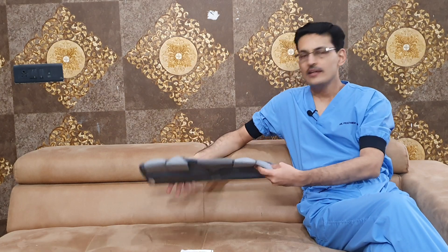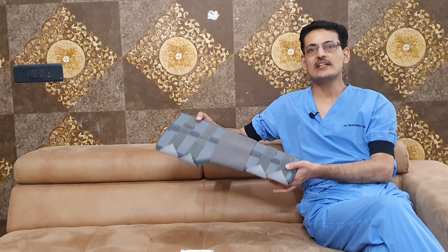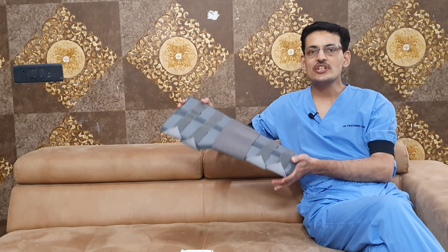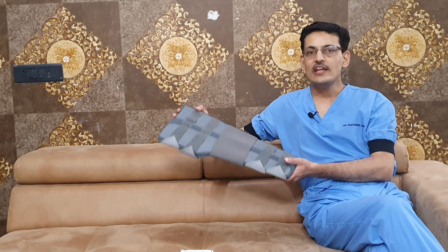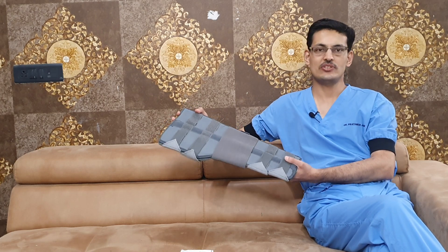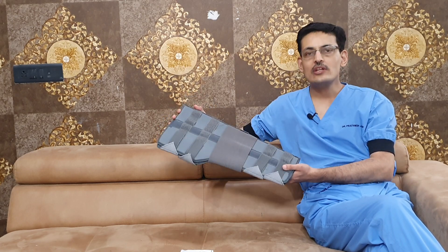First we must understand what is a brace. A brace is a support which is given to any operated limb to protect our repair and our reconstruction. The brace can be external or internal. This is a routine external brace that we apply — a very common device. We use it after the injury, after the surgery. This external brace prevents any further injuries, gives rest to your joint and protects your repair or the reconstruction, and is a very useful device to protect your knee from any damage.